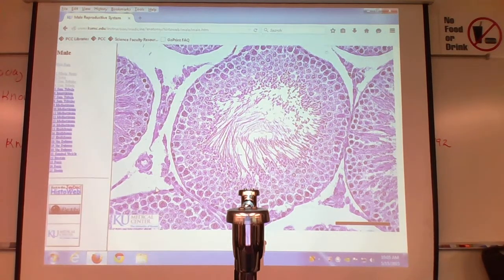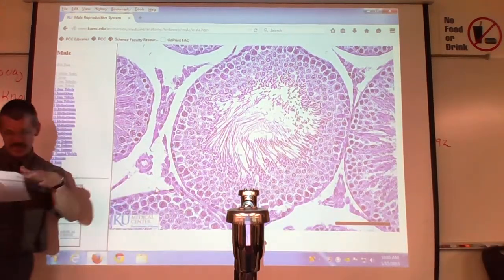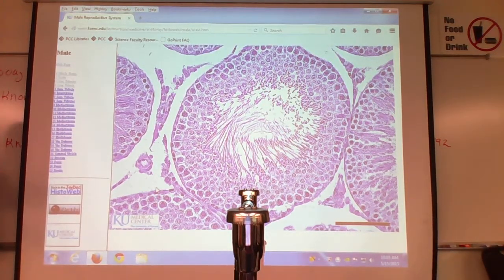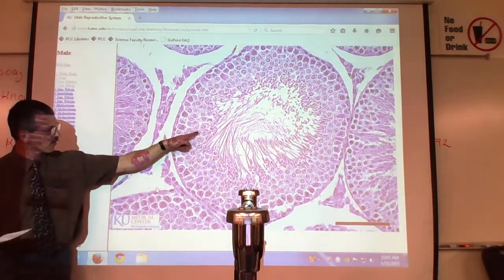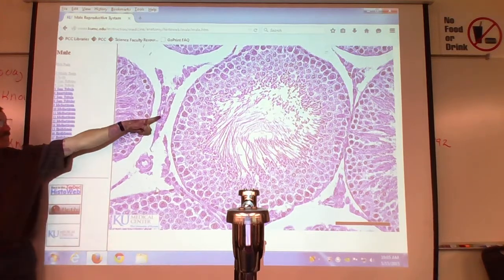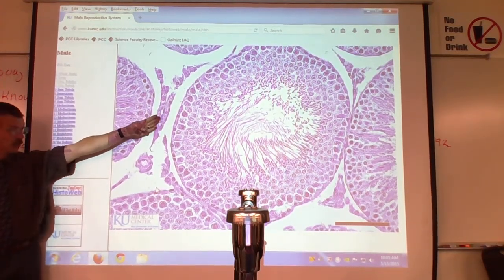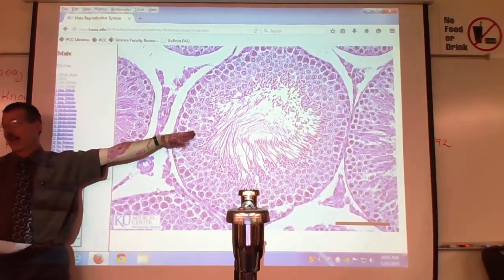Then we have the one in the ring. So let's see. They're going to make sperm. How would we say sperm-making cell? Spermatogenic. Sperm, genesis, creation of. So spermatogenic cells are the cells making the sperm. So these cells here are my interstitial or Leydigs. They're not the circle. These are spermatogenic. They are the circle. I am the circle.